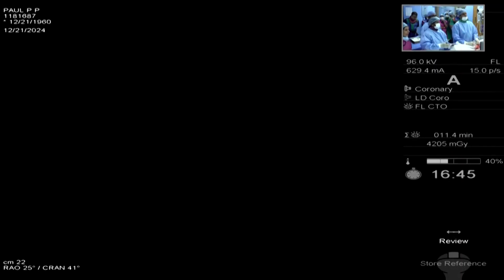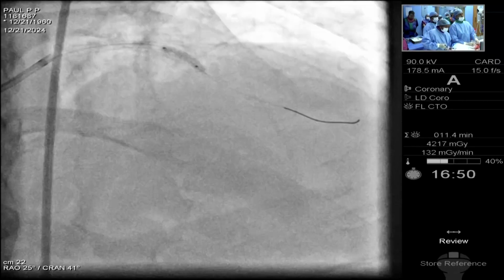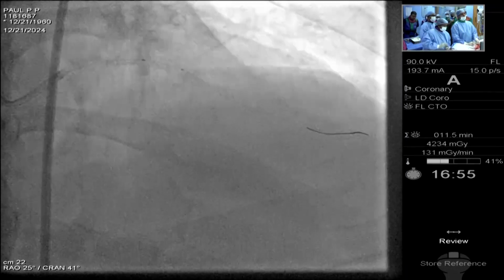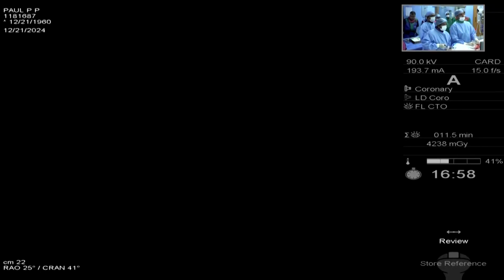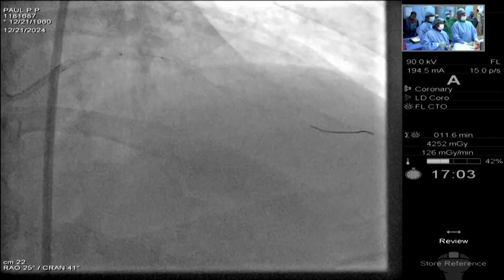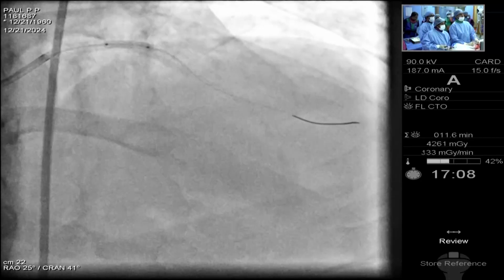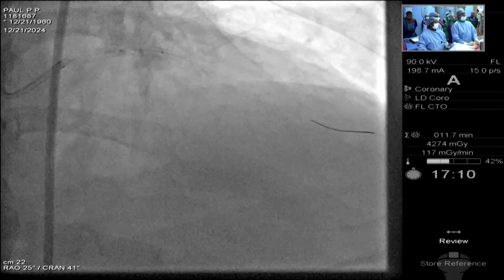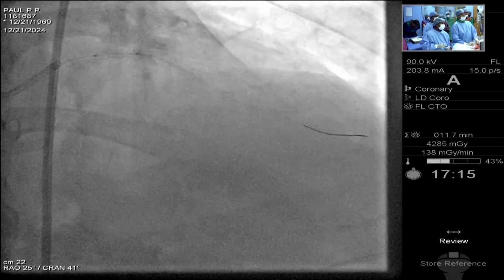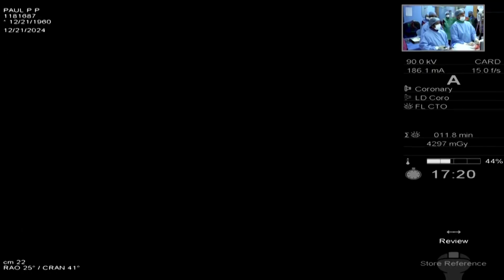Okay. 14, 16. Negative. 18. Negative. Again 18, 20. Negative. We'll take 3. Okay. 18, 20, and now 3.5 below. Yes, anything is okay. 8 or 12.